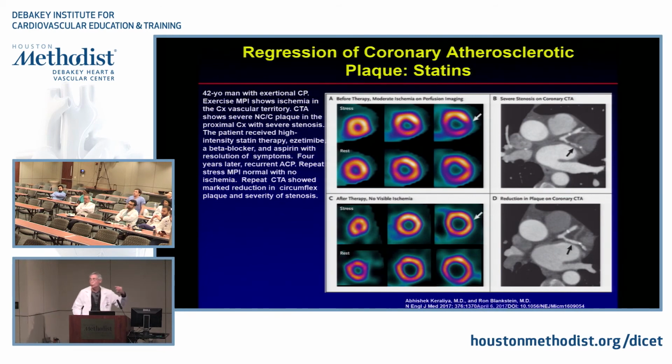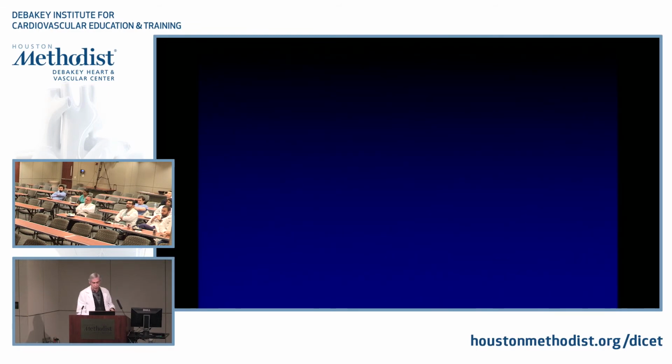These are all potential reasons why there might be improvement. But I think, especially with the low radiation and with CTs, this might be a very nice way to be able to track whether therapy is doing a good job or not. Whether you really have optimized your therapeutic approach to the best possible means for any given patient. So that's kind of the deal there.